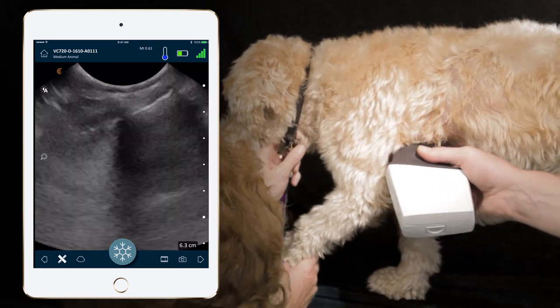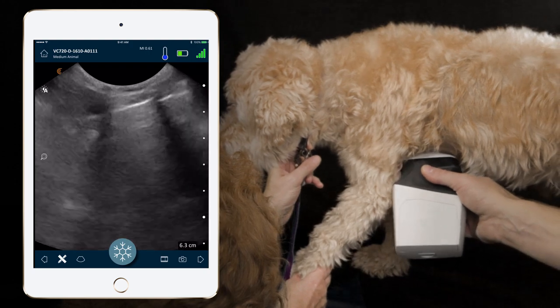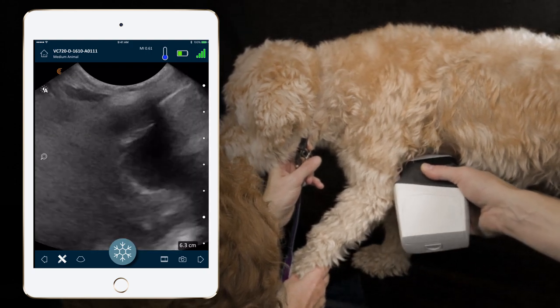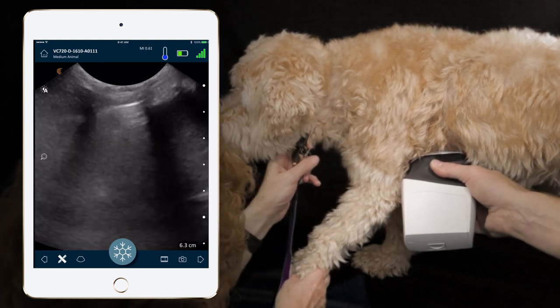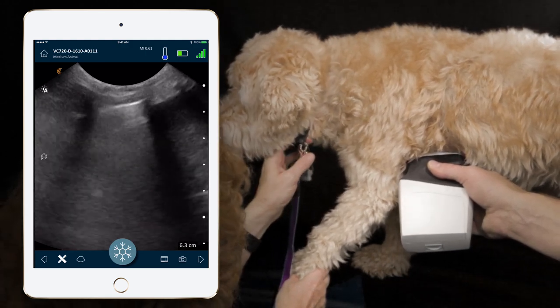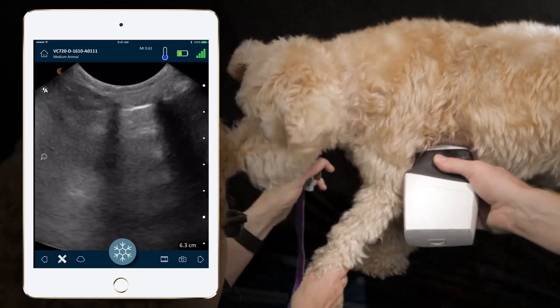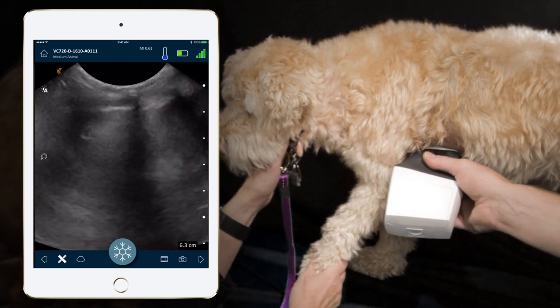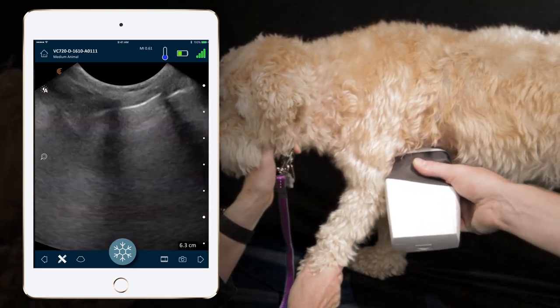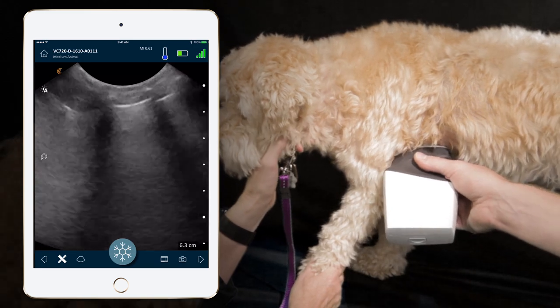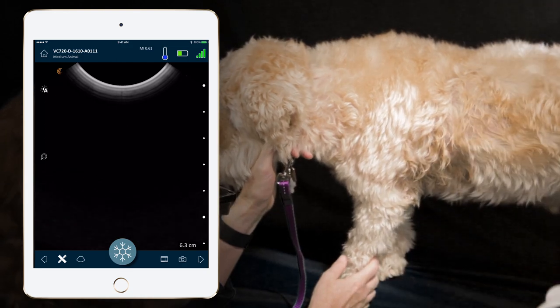Once that's done, we'll come back to the heart as our landmark, and once we've got the heart in view, we'll move it a little bit caudal. We look between the diaphragm — visible in the caudal field as a curtain sign moving in and out of view — and examine the parietal pleural interface for the presence of pleural effusion, as well as interstitial alveolar disease represented by B-lines, which we don't see in this particular patient. Once we've completed those four regional sites on one side, we'll do the same four sites on the other side.